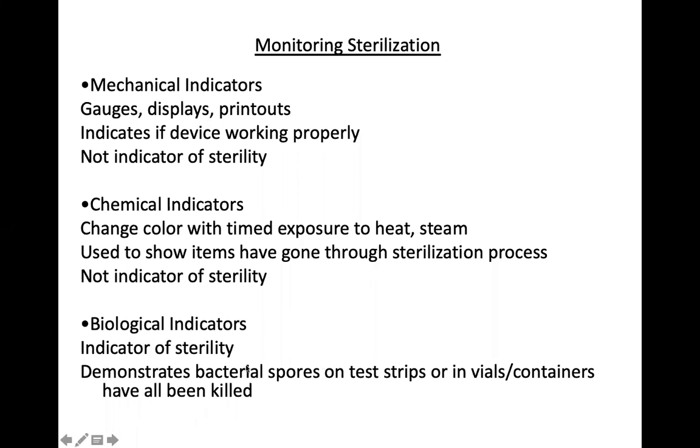Now, these are not any spores. This is not any spore that you use. This is a standardized spore. There are different species of bacteria that can be used. But what is special about them, one is called Bacillus stearothermophilus, is that it is a species of bacteria that can withstand very high heat.